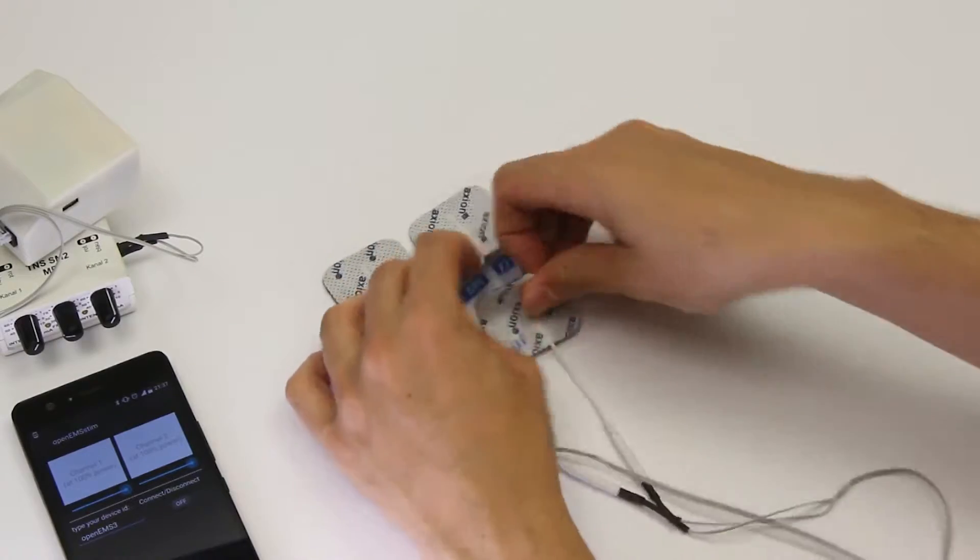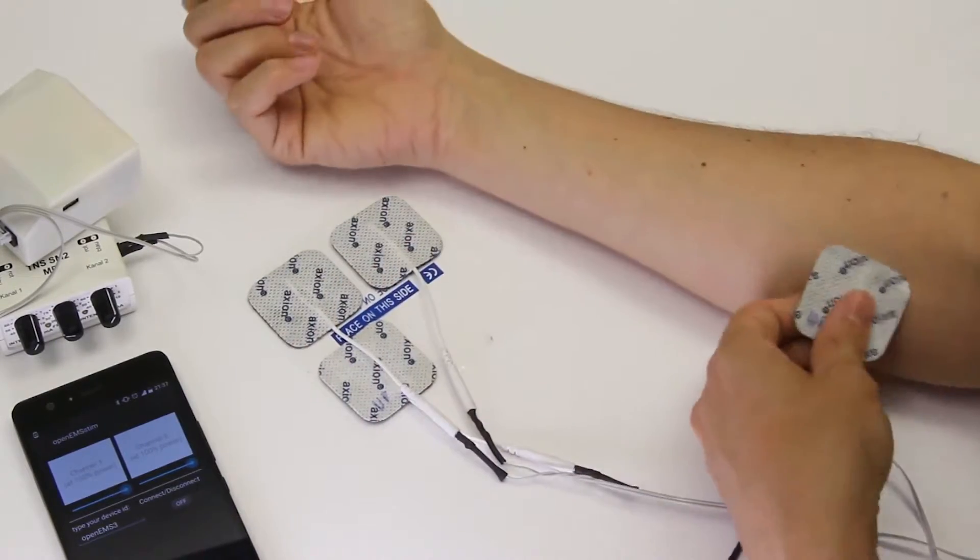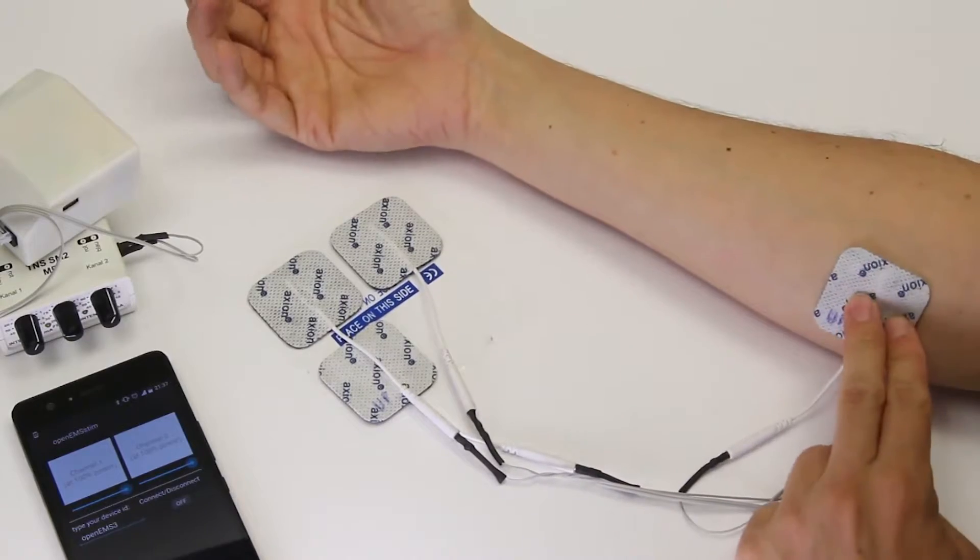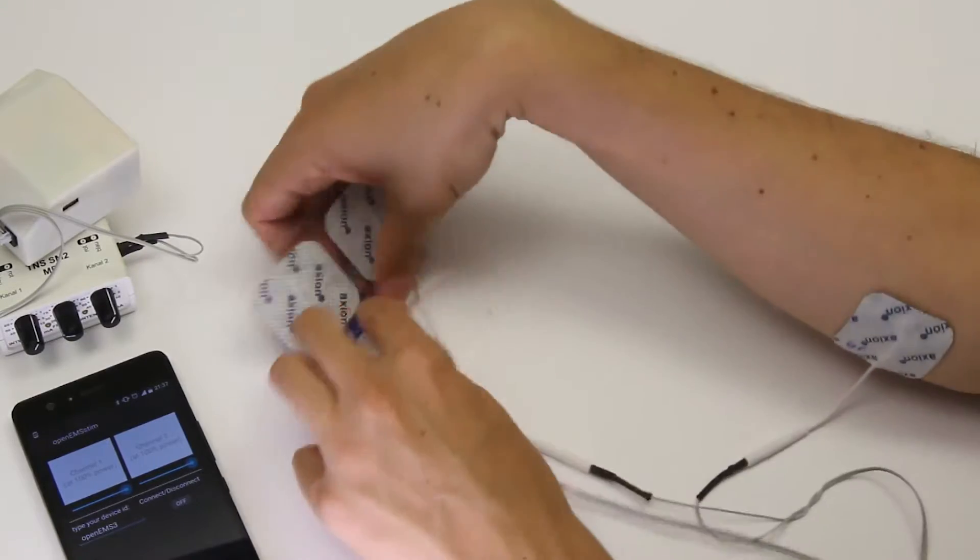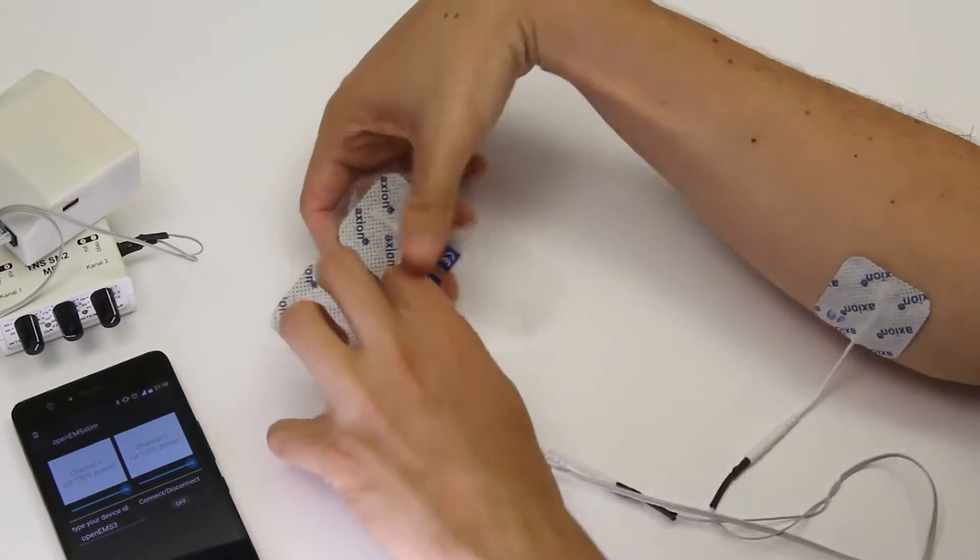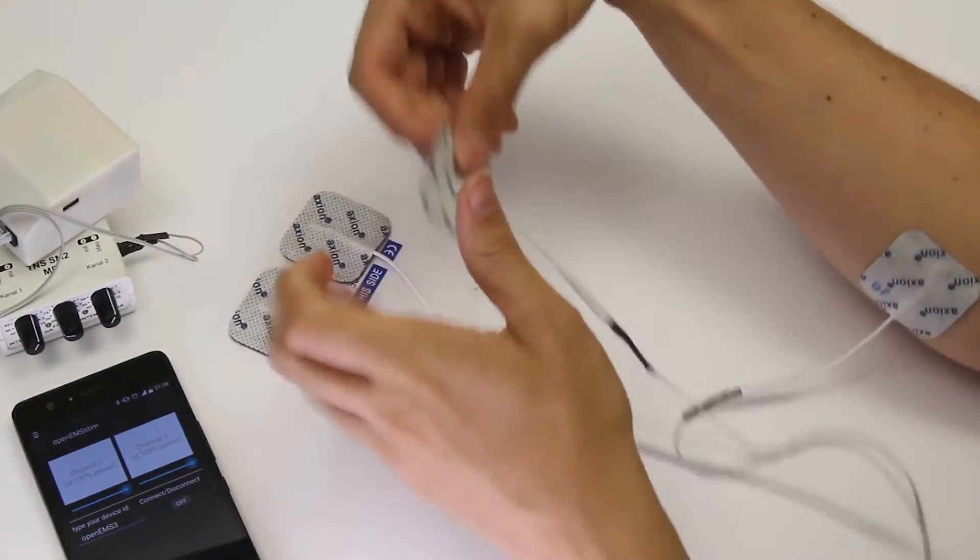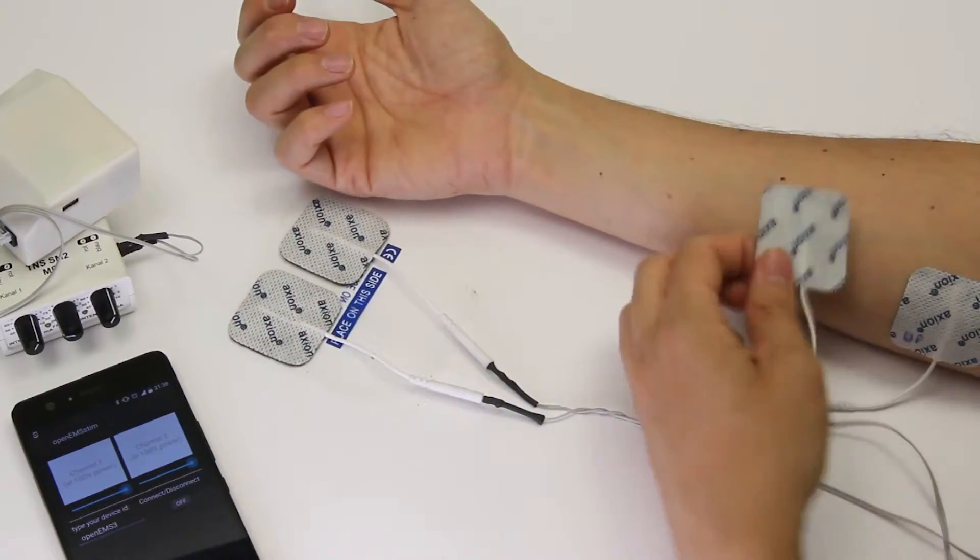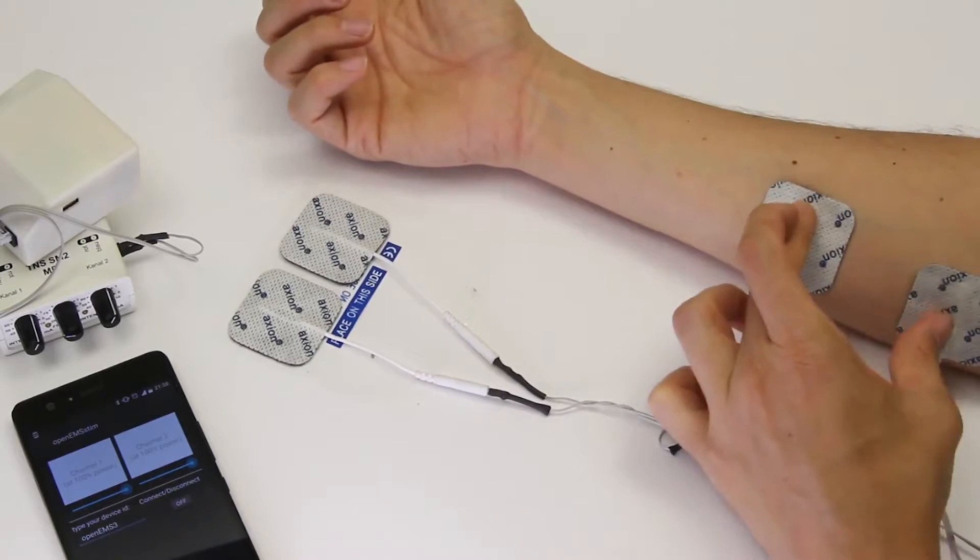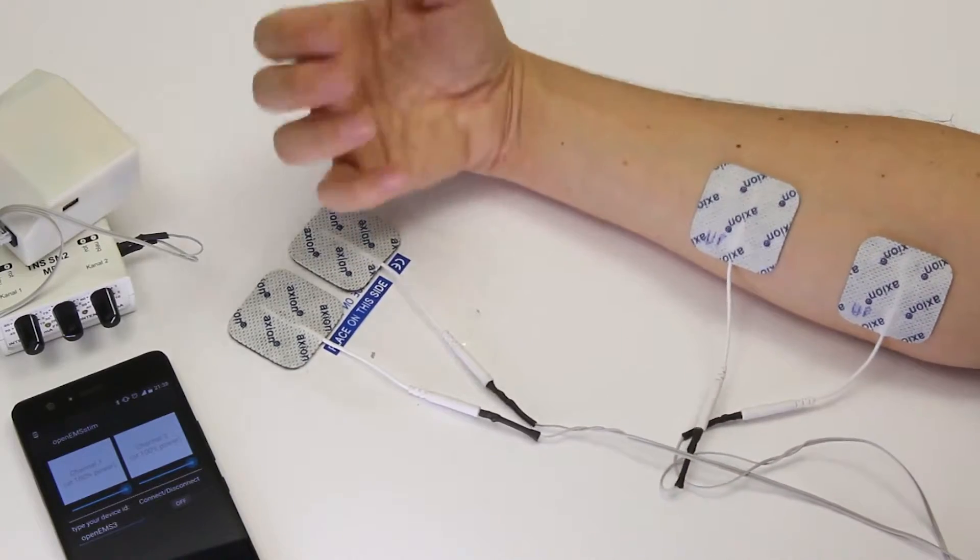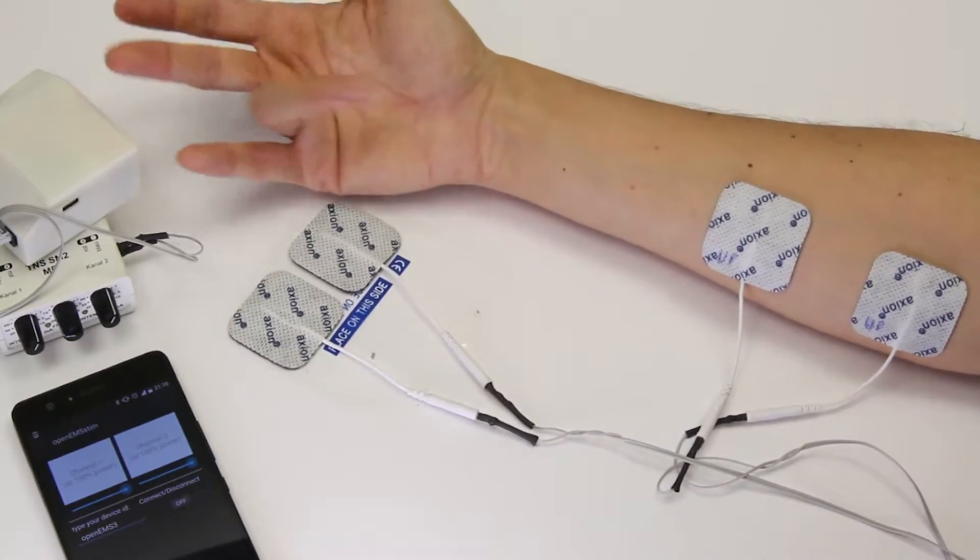So one electrode on the base of the muscle, of the palm flexor, and just two or three fingers away slightly more upwards you're going to place the second electrode. That's the muscle that moves the palm inwards, actually moves the wrist but also moves that finger muscle there.